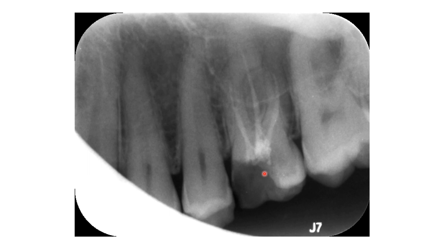For this case in particular, don't start by looking at the apex. For the mesiobuccal root, we will start by tracing the periodontal ligament space from the alveolar crest — this way, this way, this way. This is the radiolucency over here. We will see that this root is dilacerated in a distal direction and the filling is actually short.